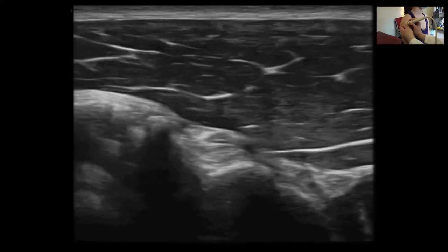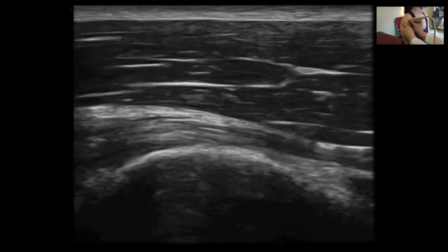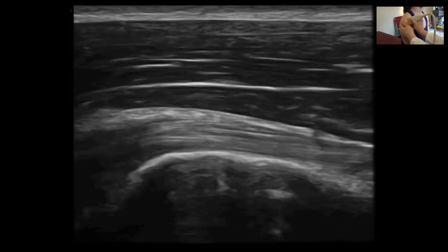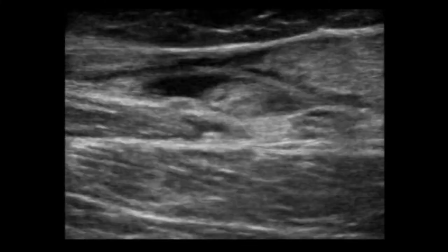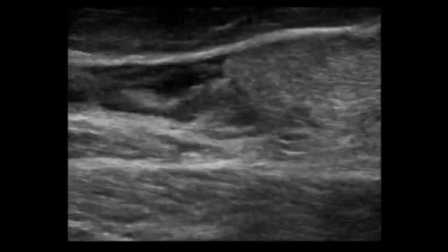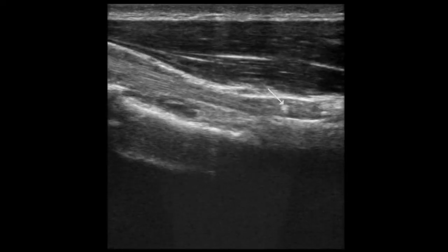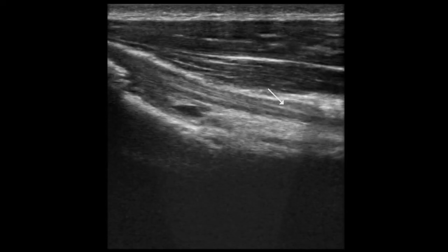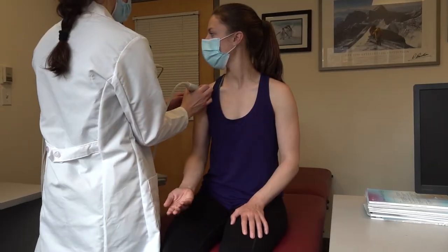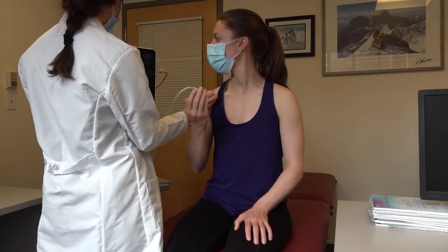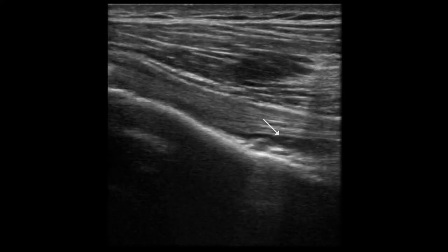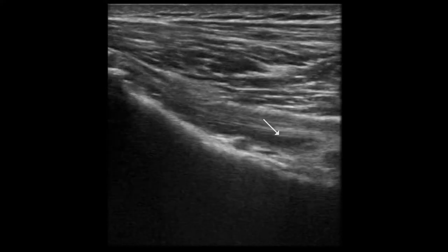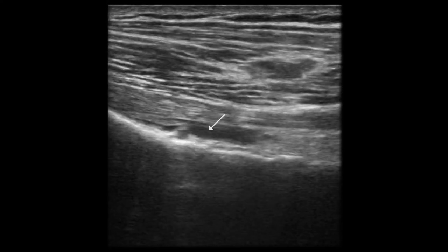With the biceps tendon in the center of the screen, rotate the probe so the marker points cephalad to examine the tendon in longitudinal view. Tendon tears and ruptures may be identified by tendon irregularities and surrounding hypoechoic or anechoic fluid. Irregularities may also be noted in cases of tendinopathy. Diagnosis can be aided by having the patient supinate and flex their arm. Since the biceps tendon origin site is within the glenoid, a shoulder effusion may lead to hypoechoic fluid surrounding the biceps tendon, which can be misinterpreted as biceps pathology.